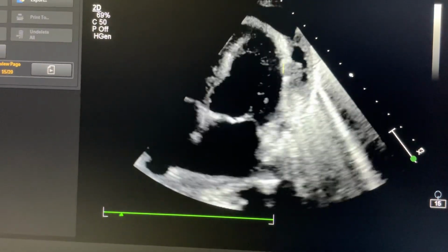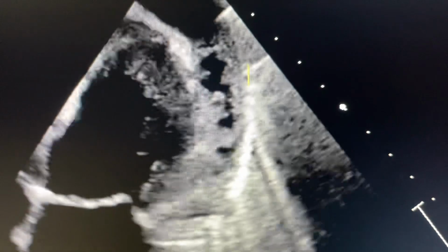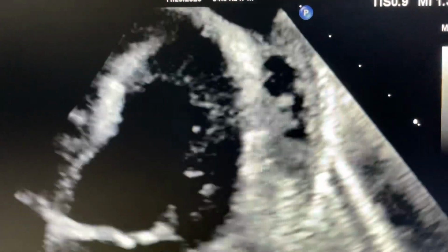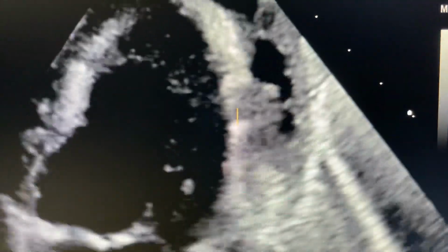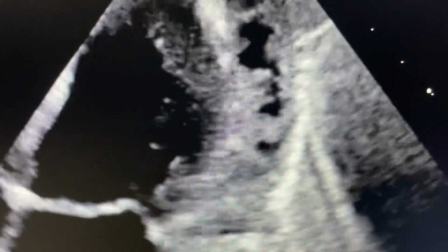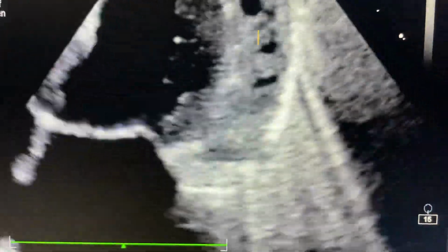This is visceral pericardium and this is parietal pericardium. Now you can easily see. Let me zoom the structure to show you. This is visceral pericardium, that means attached directly over the heart. Then there will be fluid, fibrinous band, and then the other portion, that is parietal pericardium.